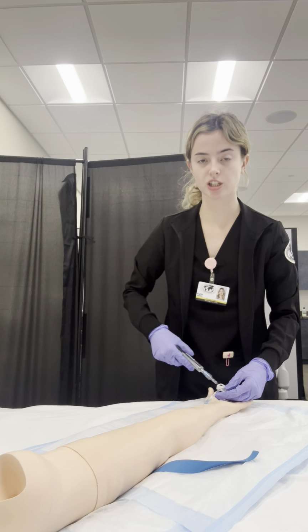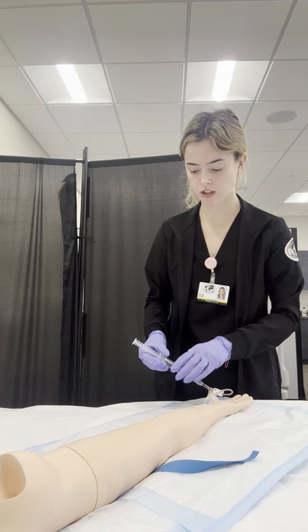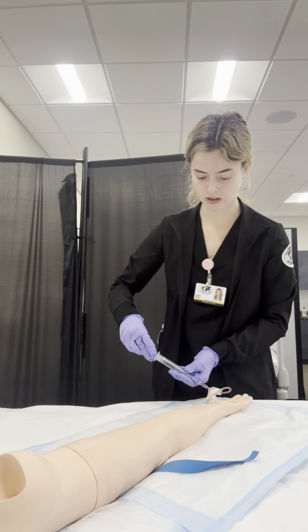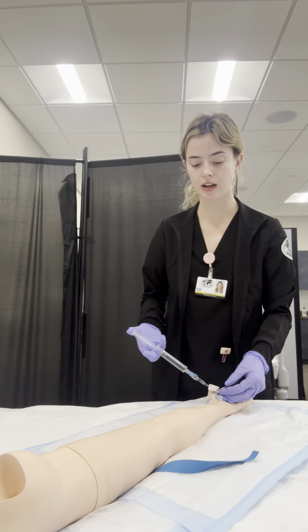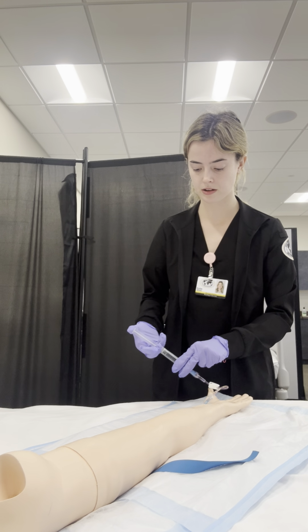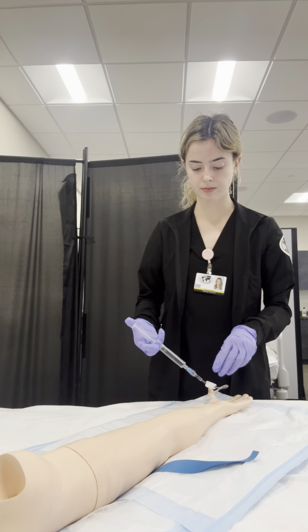Alright, so now my extension set is attached to my IV site, so I'm going to aspirate. Okay, there is blood flow back into the line, and then I would flush with 10 milliliters of the saline. So for the purpose of this video, I'll just flush a little bit. Okay, I would flush all that slowly.